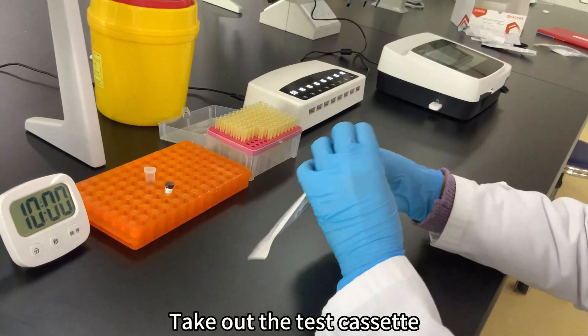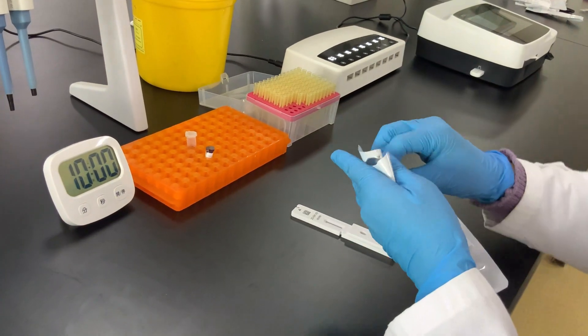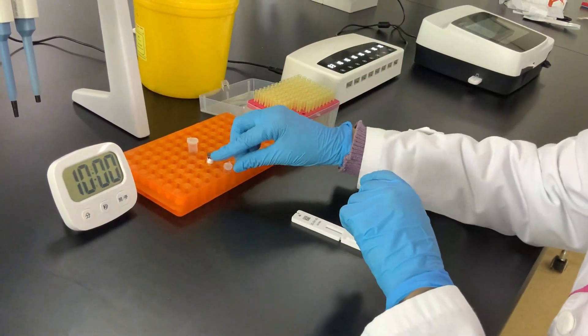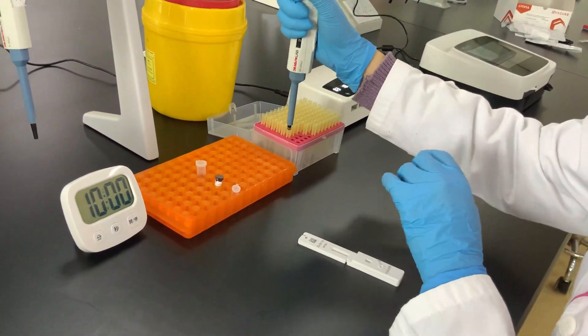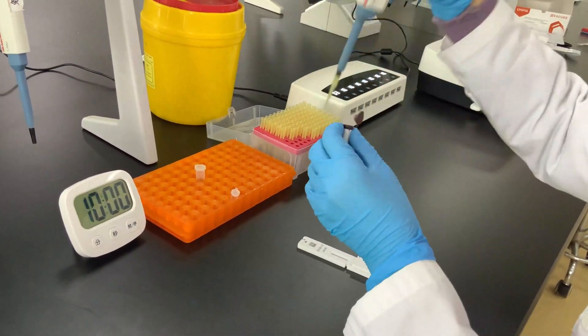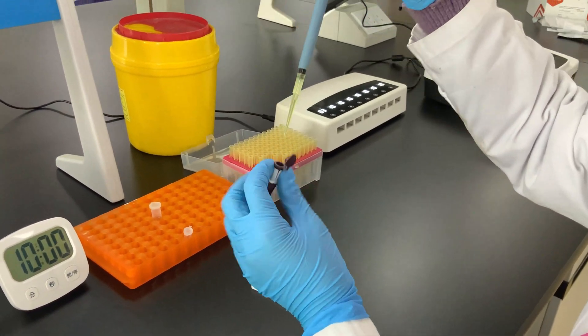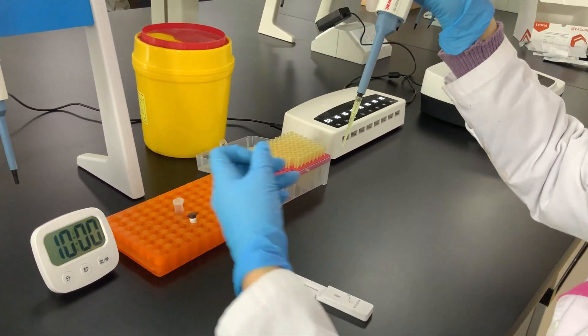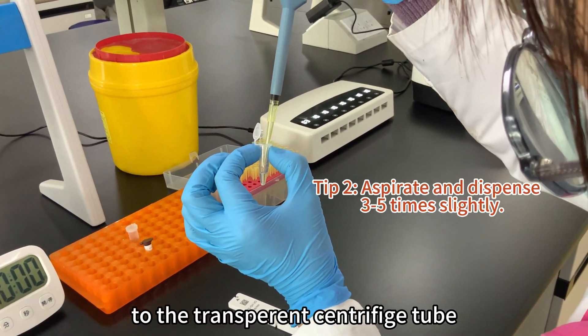Take out the test cassette. Pipette 90 microliter sample diluent to the transparent centrifuge tube.